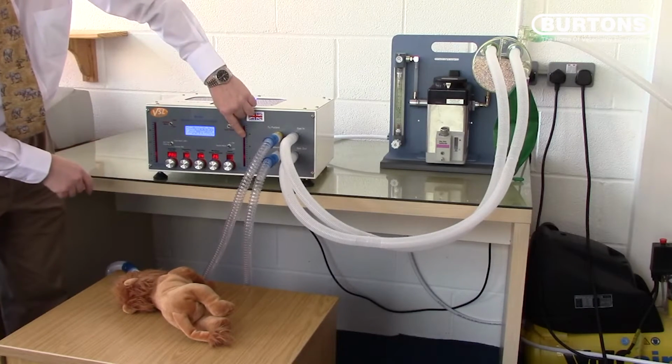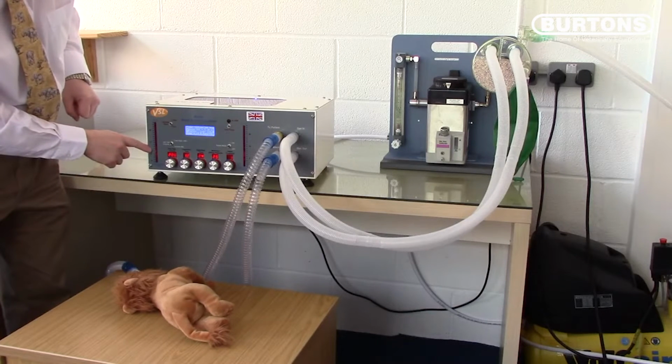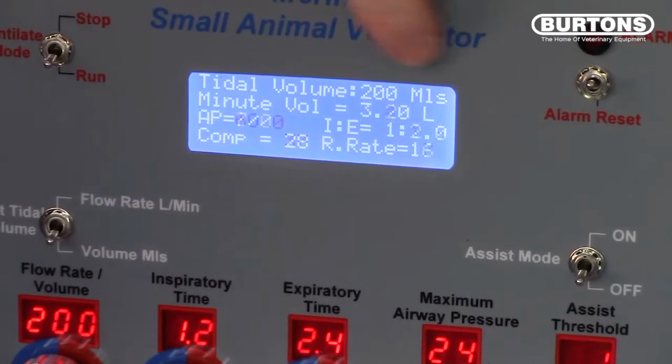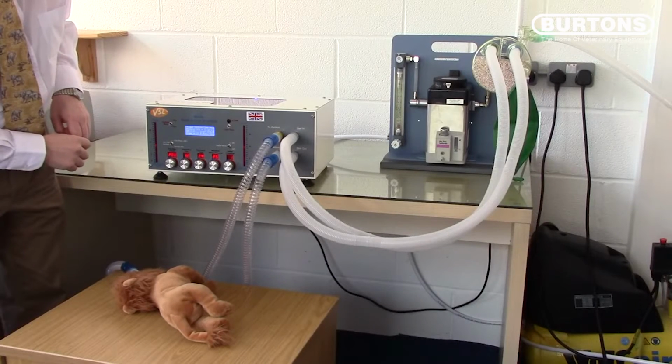See the inspiratory pressure rise on the right hand side and the expiratory port pressure rise on the left hand side. On the screen are all the parameters of ventilation. The tidal volume is set to 200 mils and the minute volume is 3.2 litres because the respiratory rate is 16 breaths per minute. We can see that the IE ratio is set to 1 to 2, and watch the airway pressure as it rises up to 13 during each breath. And notice the chest movements of the patient as it's ventilated.